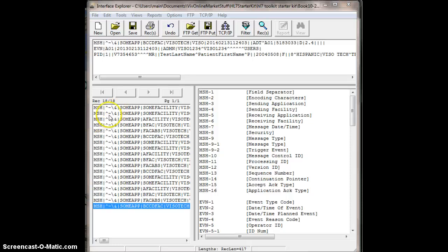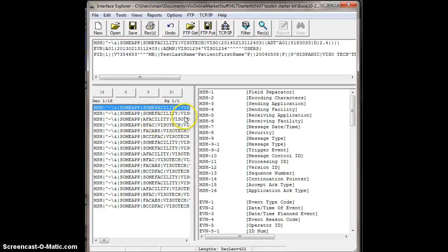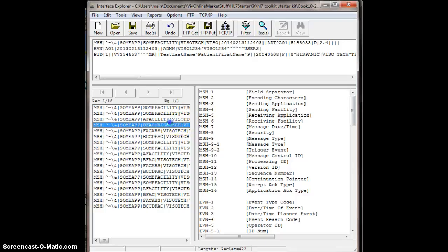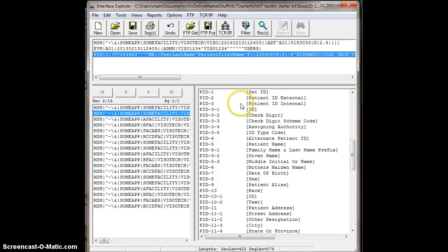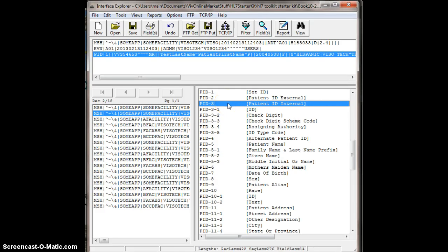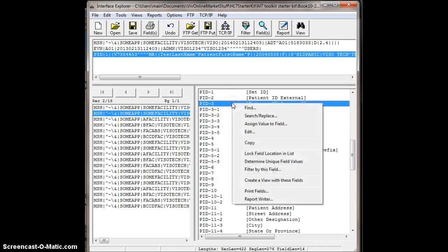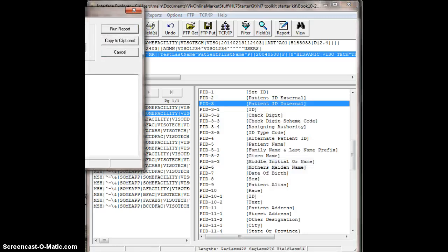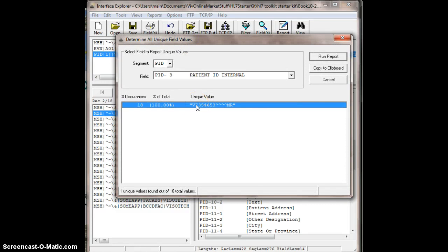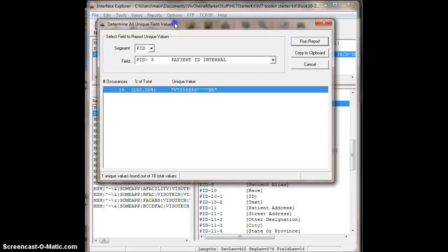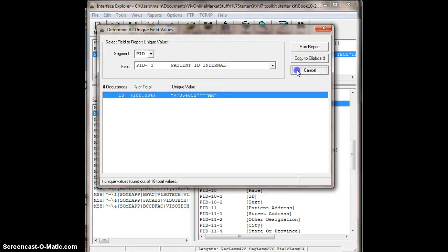Now you can determine unique values across multiple message fields. I've made a video on that. I'll put a link to the video in the notes. But let's say you want to know all of the PID3s. Let's go to PID3 because everyone knows that's MRN. How many PID3s are in here? We know there are 18, but what are the PID3s? Right-click, determine unique field values, and here we go. Out of these 18 messages, there is just one PID3. So these 18 messages are all a result of one patient. It tells a story about that one patient.